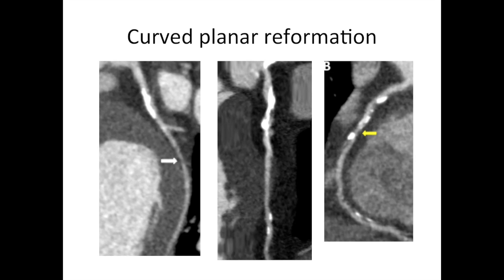Coronary arteries can be displayed in lots of different ways. We can look at them on axial imaging, or we can do curved planar reformations. These involve drawing a centre line down the middle of the vessel, either automatically or manually, and then displaying the coronary artery in curved or straightened-out form. This is very useful for assessing the degree of coronary artery stenosis.